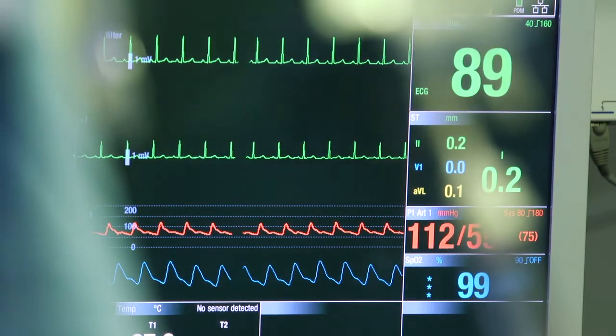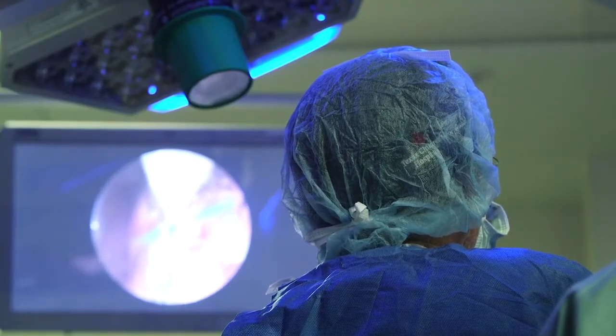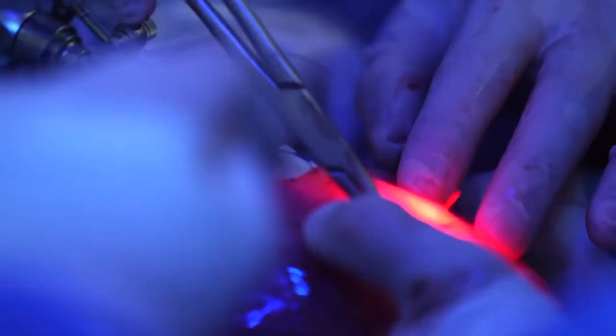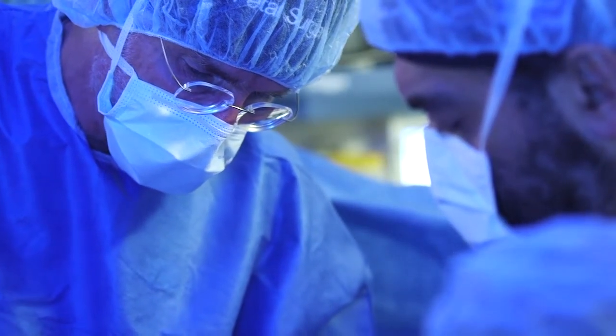Belfort and his team have shown performing the surgery fetoscopically yields the same outcome for the baby as the open repair, while being significantly less invasive for the mother. Because we believe that the fewer openings you make in the uterus, the less chance you will have of preterm labor, of leakage of fluid, of complications.